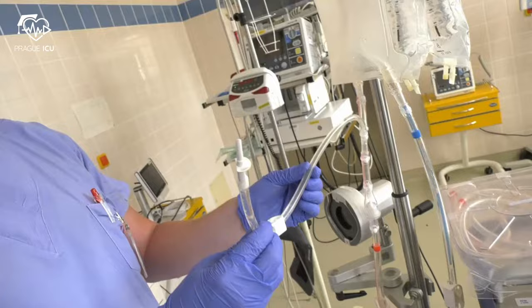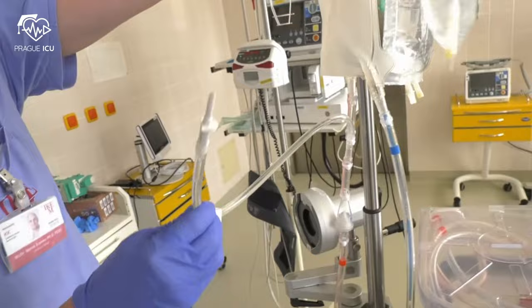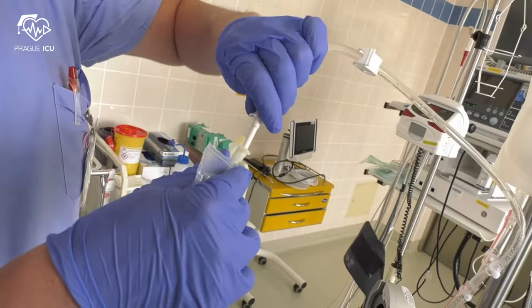The red line doesn't need to be clamped as there is a one-way valve. Fill the priming bag with two liters of saline through the spike of the priming line.